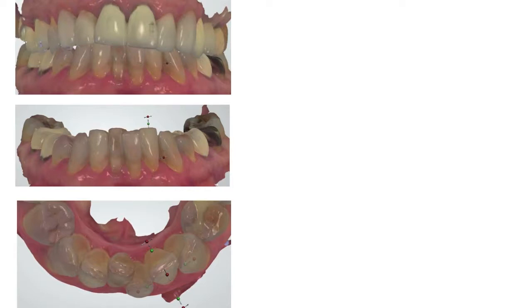Question number 2, when the teeth are extracted, can the implants be placed immediately? Now, what's going to be important to know relative to that is where are the implants going to go? Where are the teeth going to go? If the implant positions and the tooth position is going to be similar to where they are now, then perhaps the implants can be placed at the same time of the extraction of the teeth. Well, that's not going to happen if there are 3 teeth to replace now those 4 teeth. So then you're going to have to extract the teeth, allow the area to heal, and then come back. Otherwise, you're going to be forced into an area of one of the extraction sockets.